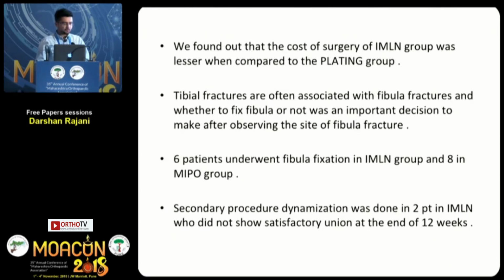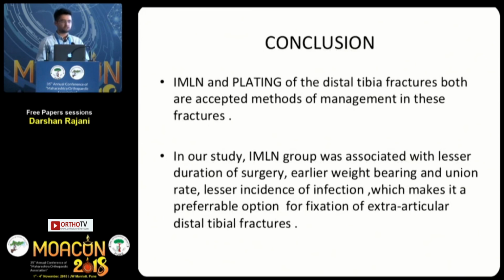We also found that the cost of surgery of the interlocking group was lesser when compared to the plating group. And 6 patients underwent fibula fixation in the nailing group and 8 in the plating group. Dynamization was also done in 2 patients in the nailing group. Conclusion: both the methods are accepted methods, but the interlocking group was associated with lesser duration of surgery and lesser incidence of infection, which makes it a preferable option.